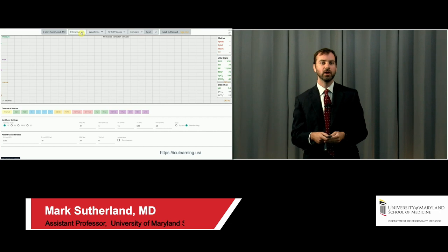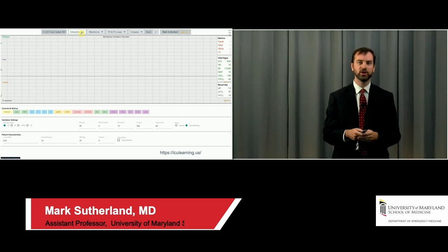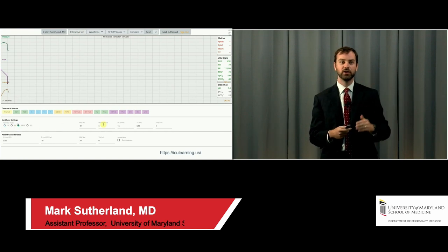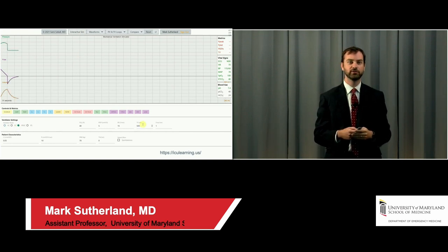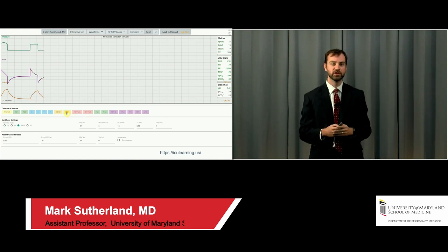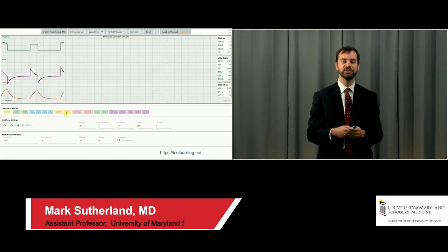So just to orient everyone a little bit before we play the video, we're going to see across the top center there, and actually it looks like the video started, so that's perfect. What we're seeing there are the pressure, flow, and volume waveforms. So this is, I've switched the patient to PRVC.